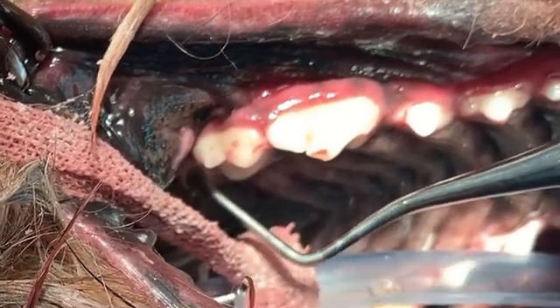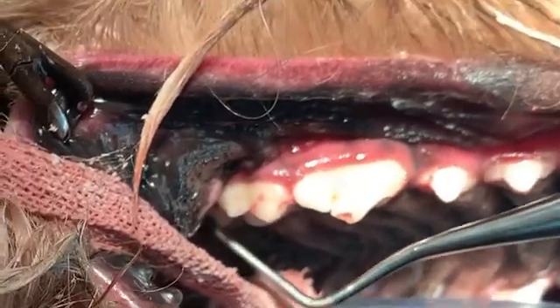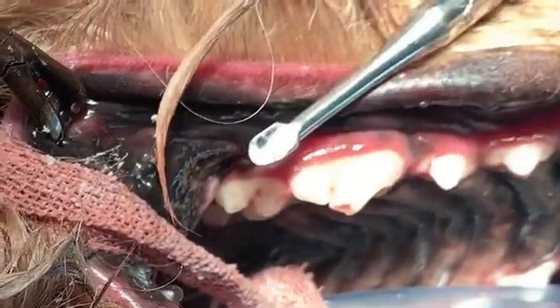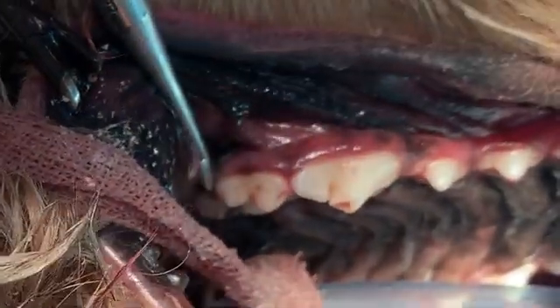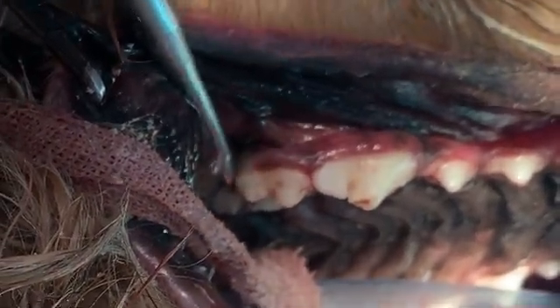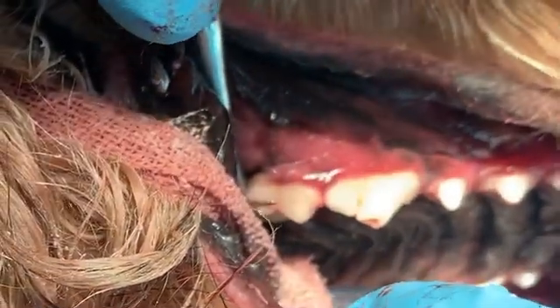So what we're going to do — it's wiggly and mobile, and there are big pockets around it — we'll get a big Luxator, way bigger than we would typically use on this dog for anything except maybe the canines. And we're going to go in perpendicular to the teeth instead of parallel to the root.